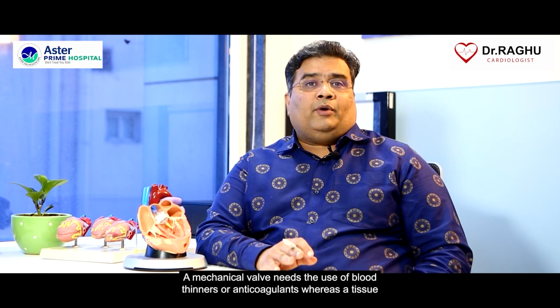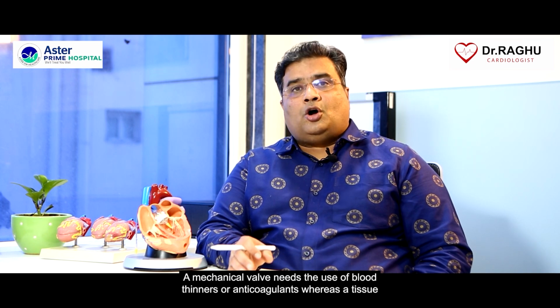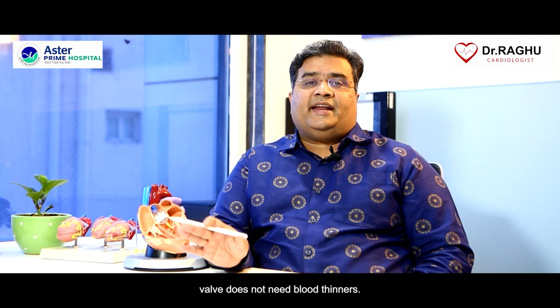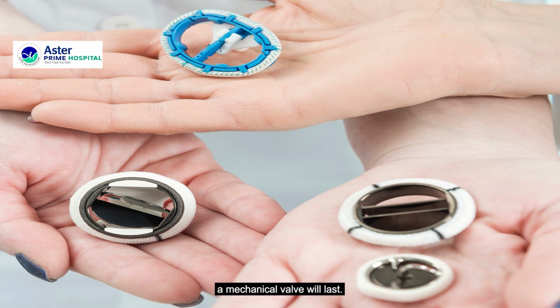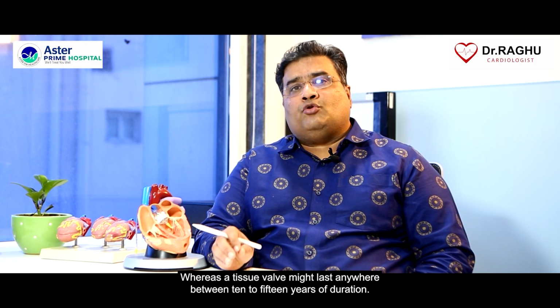A mechanical valve needs the use of blood thinners or anticoagulants, whereas a tissue valve does not need blood thinners. A mechanical valve lasts for decades, usually 2 to 3 decades or even 4 decades, whereas a tissue valve might last anywhere between 10 to 15 years.